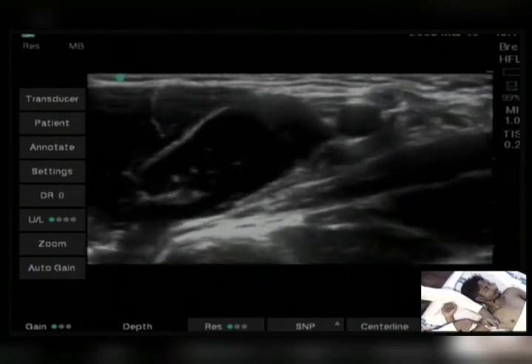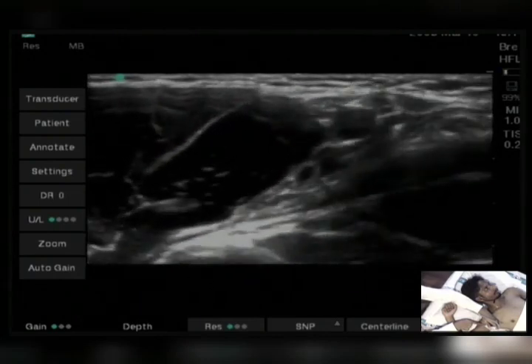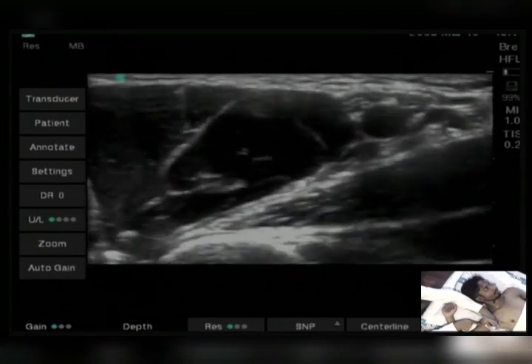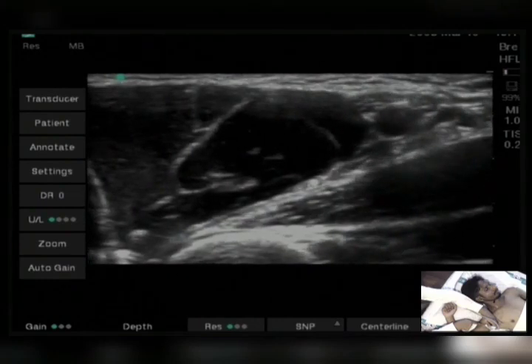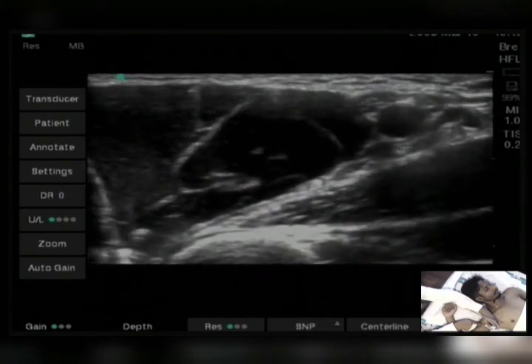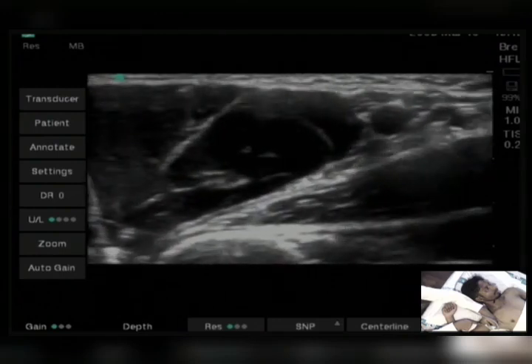towards, from the same skin puncture, the radial nerve over here. See, this is the conjoint tendon, which gives you a landmark that you do not have to pierce this conjoint tendon. The drug deposition should be superficial to the conjoint tendon, and this is the radial nerve, somewhere here.